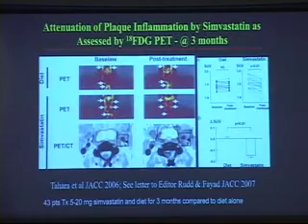What's even more exciting in the recent report is that this signal can be modulated by known therapy, such as LDL reduction therapy and statin. And what's even more important is that the reduction can be measured and can be seen very early on after treatment, at 3 months. This is probably the fastest time that we're able to measure, maybe USPIO around the same time.